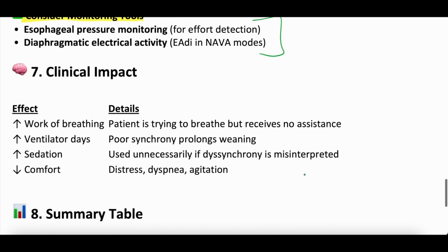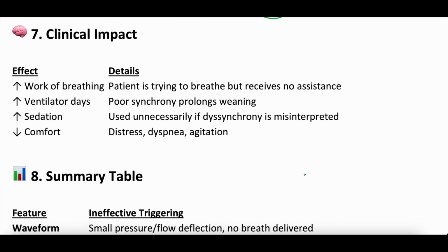So from a clinical standpoint, just to finish things up, ineffective triggering can increase the work of breathing. Patient is trying to take a breath but receives no assistance. It can increase the number of ventilator days because poor synchrony prolongs weaning. Sometimes this leads to increased sedation because people try to sedate the desynchrony away. And then it decreases patient comfort, certainly. So there are some significant clinical impacts of ineffective triggering.